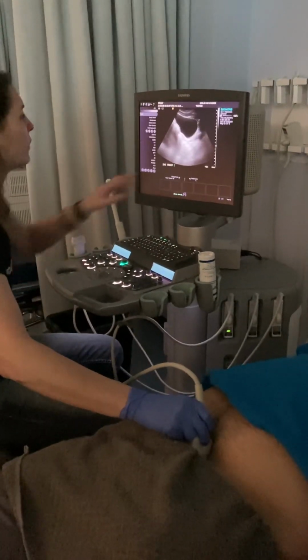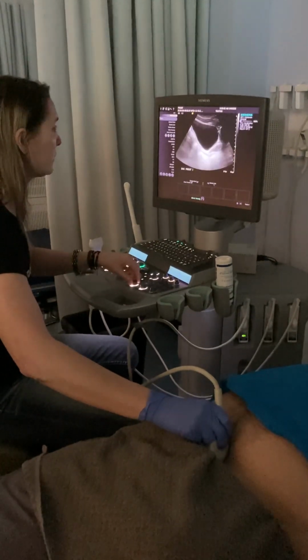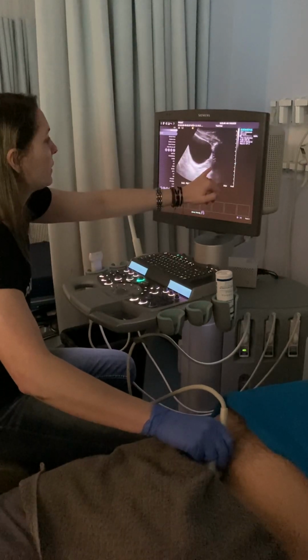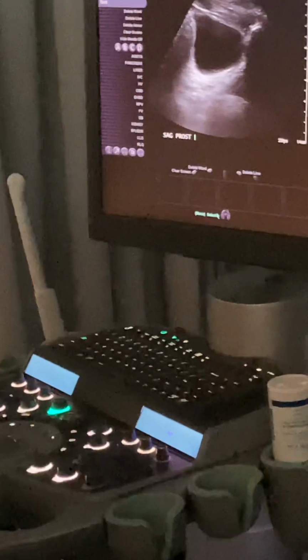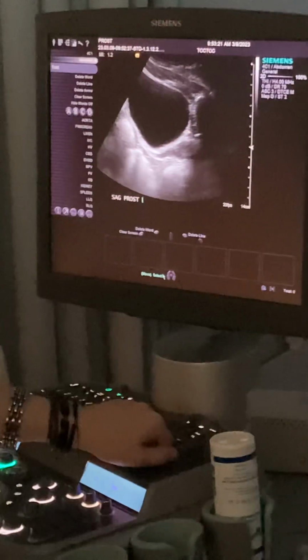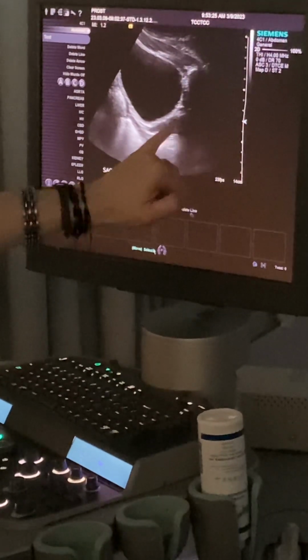And so here's the view that you guys are used to seeing for our transabdominal female pelvises. And if we just use our eyes, here's the prostate right in here. He's got one seminal vesicle creeping off right here. So the bottom of my transducer is right on that prostate, and then the top of it's more towards the right side. And then as I move across, we're going to open up to that left side, and here's the other seminal vesicle. Turn this down a little bit so you can see it. So prostate right in here, seminal vesicle.